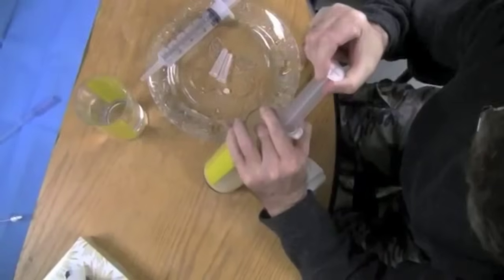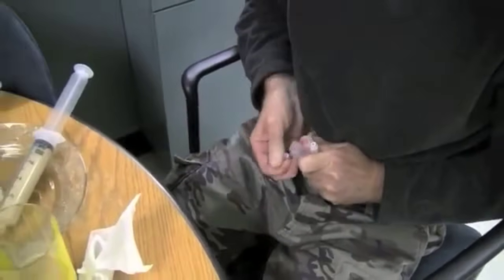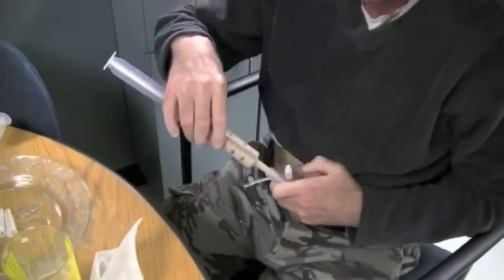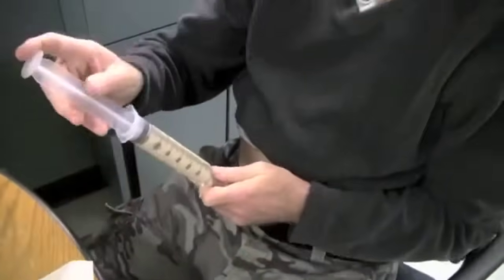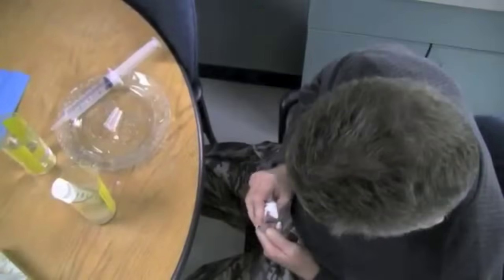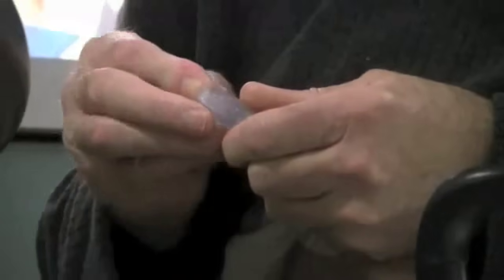For syringe feeding, fill the syringe with formula the same way you would with water. Open the tube tip and place the tip of the syringe into the end of your feeding tube and slowly push the formula in. Refill the syringe until you've used the desired amount of feed. After feeding, run another 60 milliliters of lukewarm water through the tube to flush it clear. Hold the tip above stomach level or pinch the tube and disconnect the syringe from the tube. Close your feeding tube.